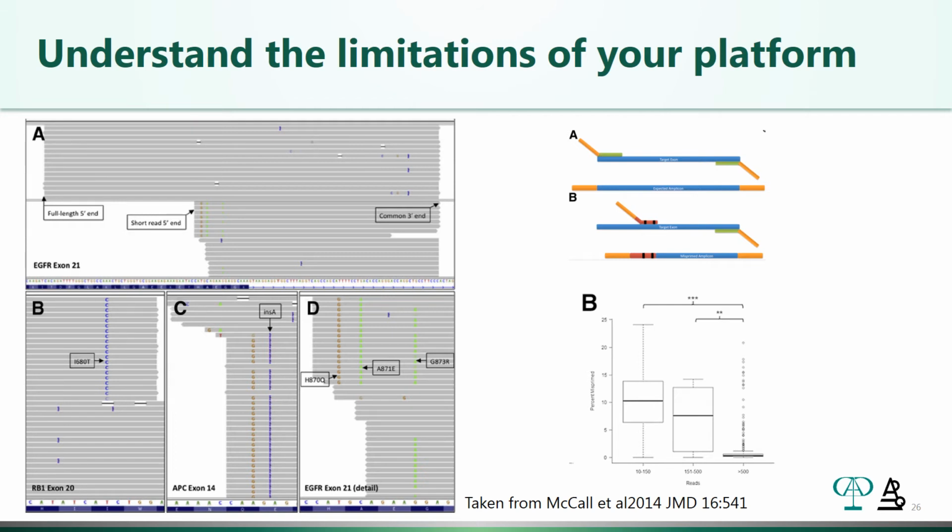Now, quite often when this happens in an assay, the assay is flagged, and this becomes what's known as a black box call or a blacklist call. So you need to be aware of these blacklist calls. It is something to understand that sometimes if you're generating your amplicons through PCR, you can have mispriming and various other events that can cause incorrect calls. Again, the clue about whether or not it's an incorrect call really comes from looking at that IGV trace, where you see that this mutation is present in multiple amplicons, but these 2 mutations are not, and therefore they are not real.